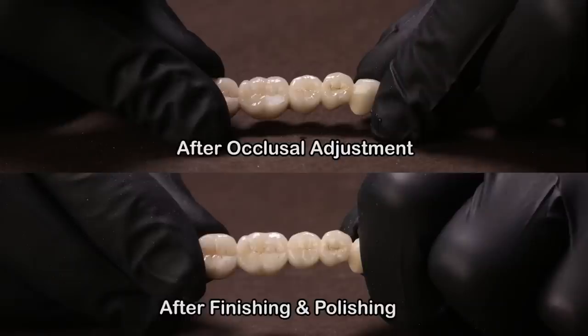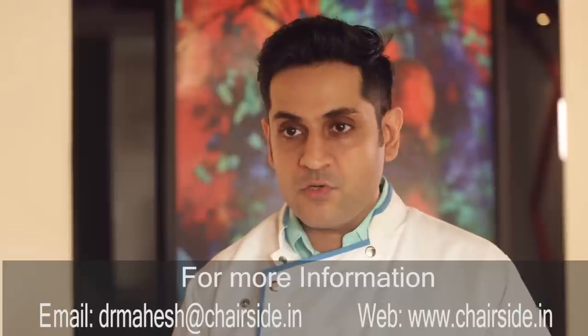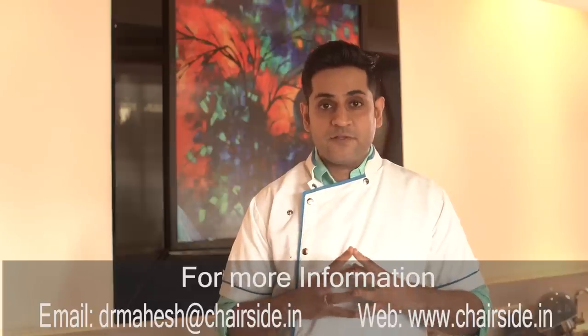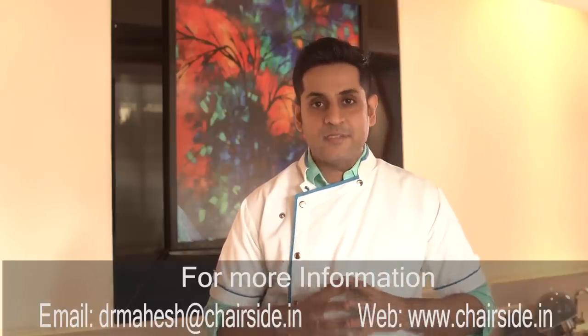There you have it — you saw how effectively we could polish this restoration, and that is what you really want to see before you cement a crown or a bridge onto the patient's teeth. I'm sure this little tip is going to be extremely helpful for all of you. For any inquiries on how to purchase this kit from chairside, you can use the comment section below or write to us on our email. Don't forget to like this video, share it with your friends, and help us grow the chairside community. Keep watching!